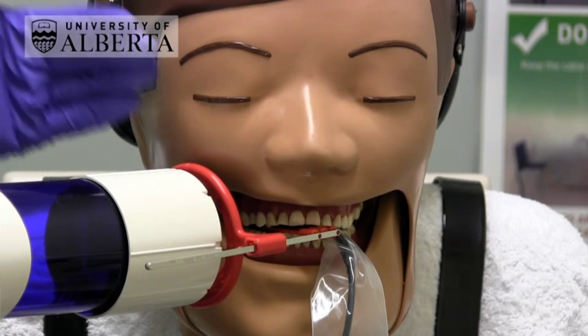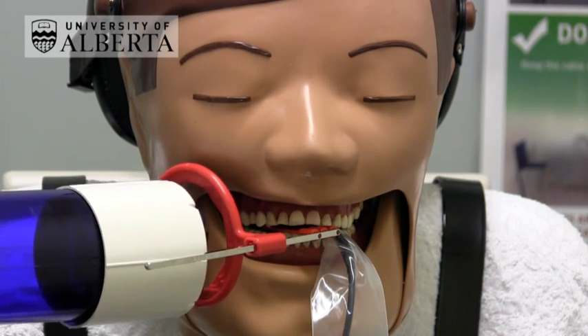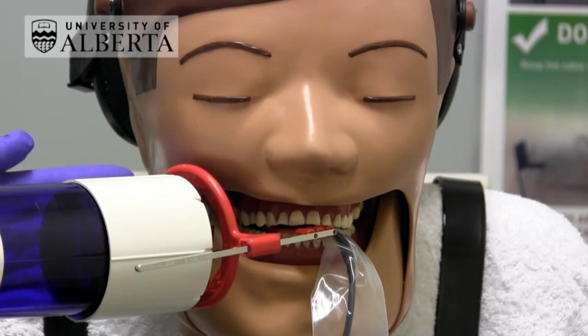For this view, when the receptor is at such an angle, alter the horizontal angulation of the x-rays by about 5 to 10 degrees so that the horizontal x-rays are going directly through the contact points. By doing it like this, you get the 3-4 contact clearly seen and you also get the contacts open, which is of paramount importance when doing bite-wing examinations.